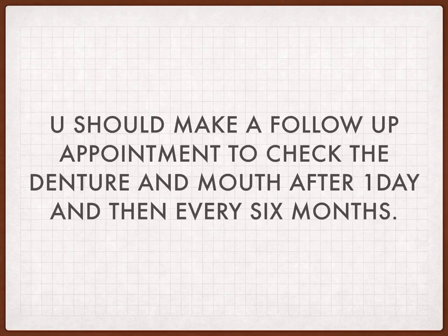And as we said, we should make follow-up appointments, and that is after 1 day to see if there is any sore spot, or after 3 days, or after 1 week, according to what is possible. And then after every 6 months to check what is happening to the teeth, if there is any mobility, if there is any periodontal disease, etc. That was a summary of the steps of making a removable partial denture.